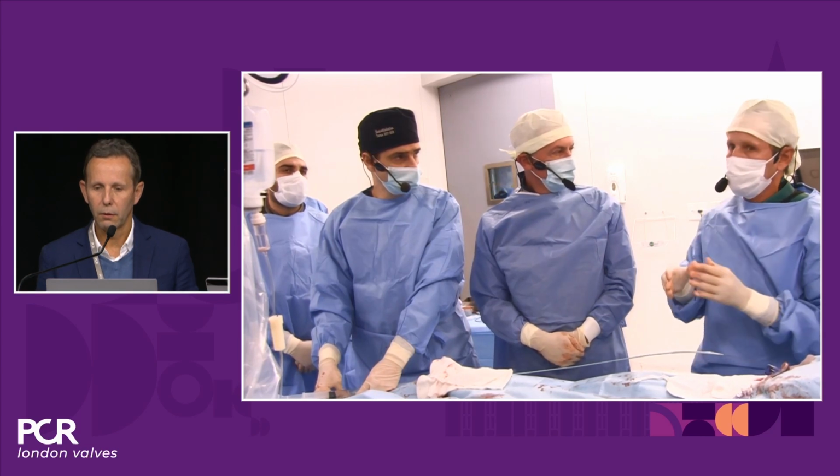And how about BAV? It doesn't seem as though you're planning BAV in this case. I think you found it not necessary, or? Yeah, for these cases, especially in this protocol with these renal failure patients, as I mentioned, the calcification is so high that we are pre-dilating the vast majority of cases. Yeah. And it can help you with the sizing as well if you do that. I mean, we have a lot of experience obviously with balloon sizing with contrast injection, but it turns out on TEE you can also see the extent to which the balloon fills the annulus, and that's another hint around your sizing. We are used to using the size of the annulus, and now with this technique we're using only the size of the sinus of Valsalva.